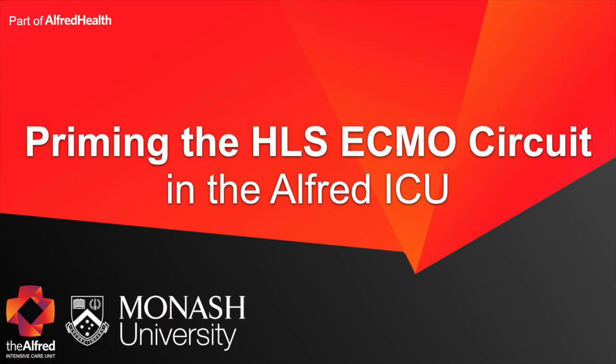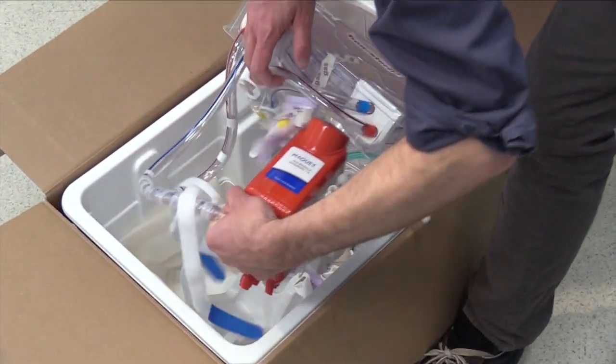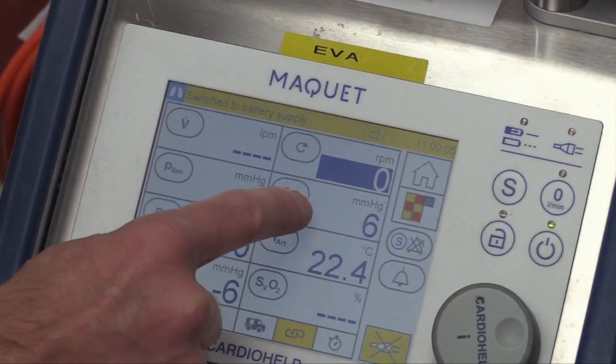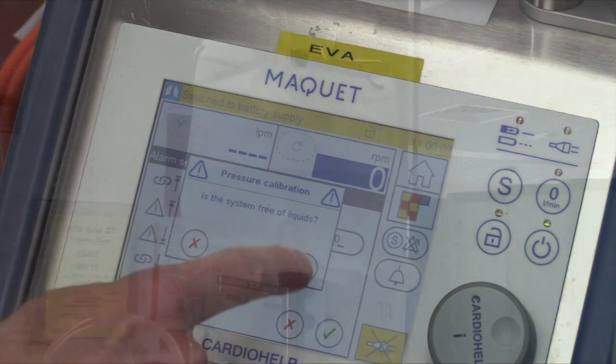This video demonstrates the technique for priming the HLS ECMO circuit in the Alfred ICU. Different institutions will have different methods for priming ECMO circuits, so please only use the method that is approved at your institution or by the manufacturer. Priming an ECMO circuit is a skill that should be learned by observation and deliberate practice. This video is not designed to be a standalone training video — it's designed to be a refresher.